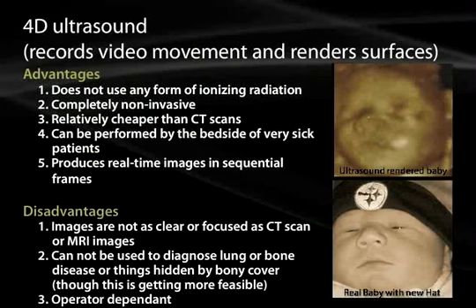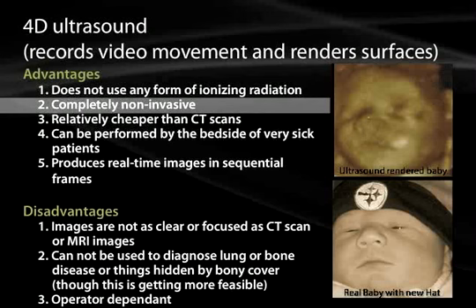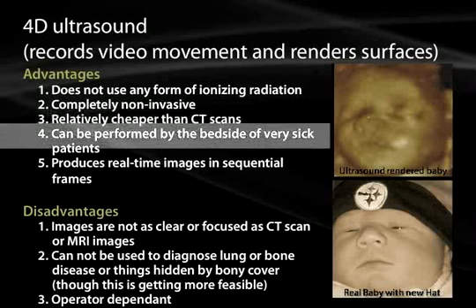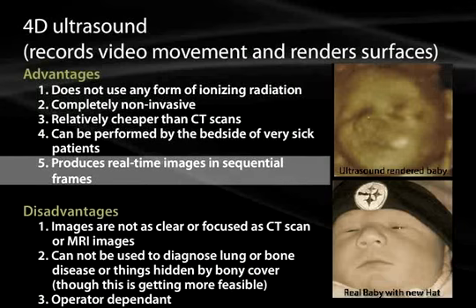When you look at ultrasound, this is a fast-moving field as well. Ultrasound is going to be using high frequency sound so that it doesn't use any form of ionizing radiation. It's completely non-invasive, and it's much, much cheaper than any of the other imaging formats. It can be performed right at the bedside of an entirely sick patient, wheeled in and out of a room very easily. And it produces real-time images that now has the capacity to add that fourth dimension of time back into the diagnostic tool.